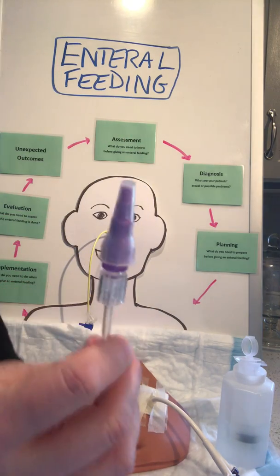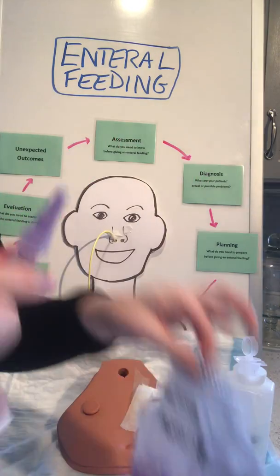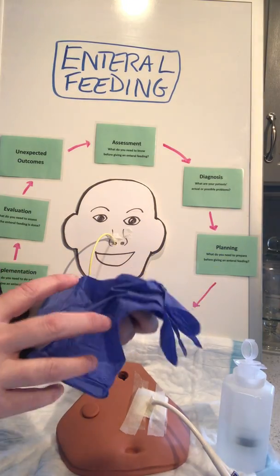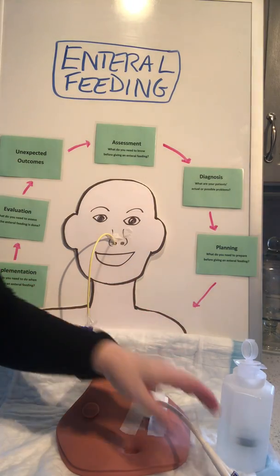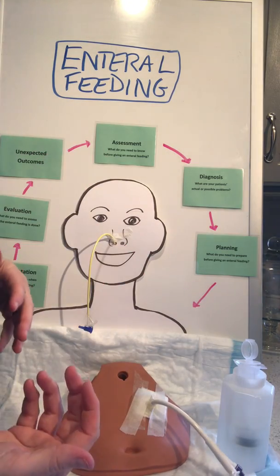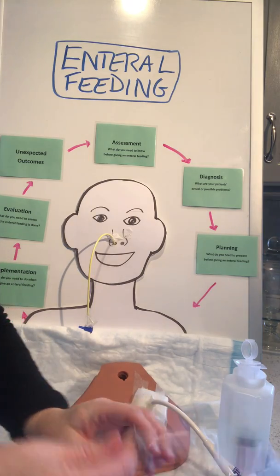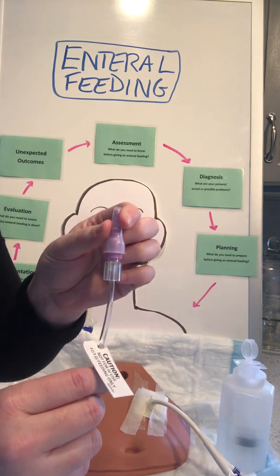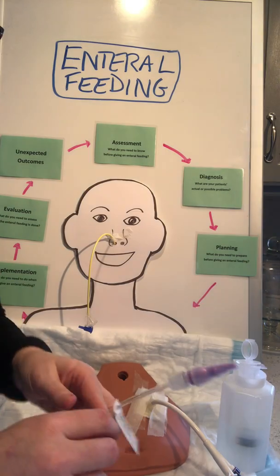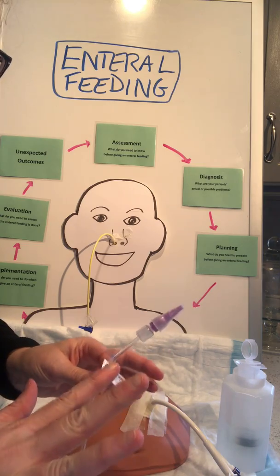All right, and then there's a cap, a protective cap, just to keep this clean. Now, this is not a sterile procedure, right? I'm going to wear gloves because I have some potential for body fluids to come out of one of these tubes and get on my hands, so I'm going to be wearing gloves. But this is not sterile. This is just keeping the tip of this clean because we're using the gastrointestinal tract, which is not sterile at all. So we don't have to worry about wearing sterile gloves or doing sterile stuff with this. Okay.